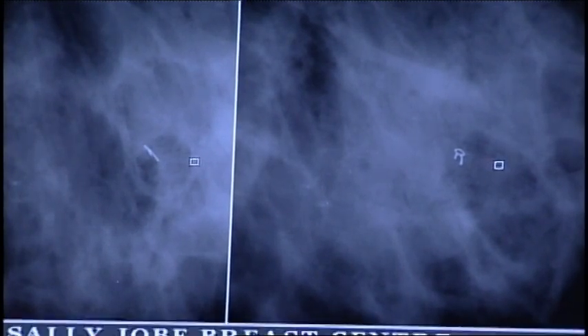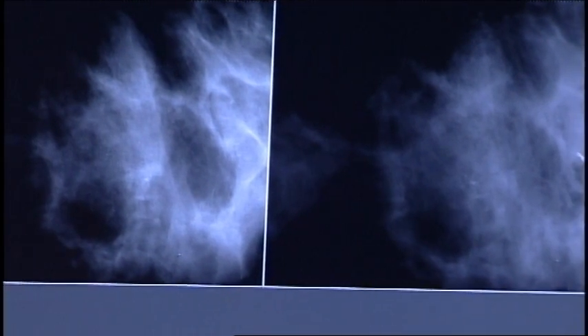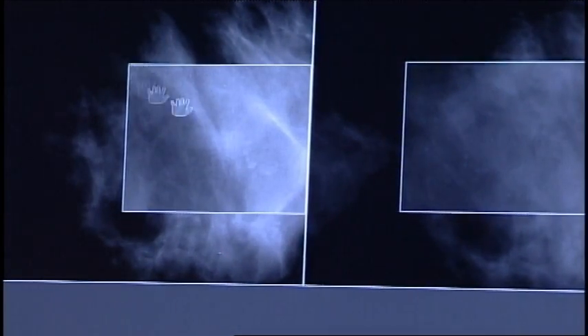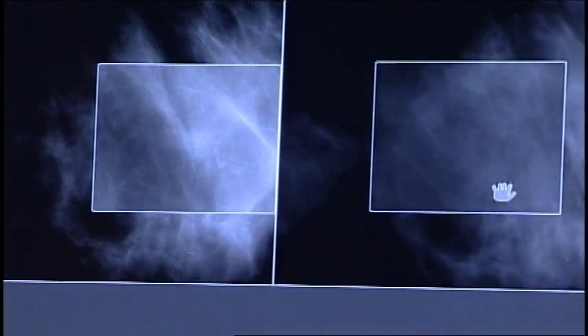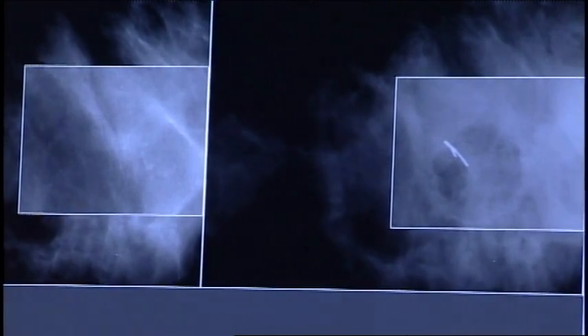We can pull up a before and after image, which is nice to show the patient that the calcifications that were there are now gone and in the specimen image. We can pull that up on the faxitron image as well.